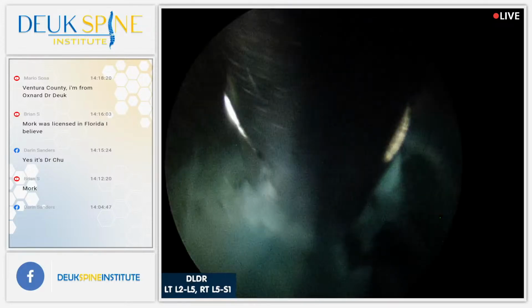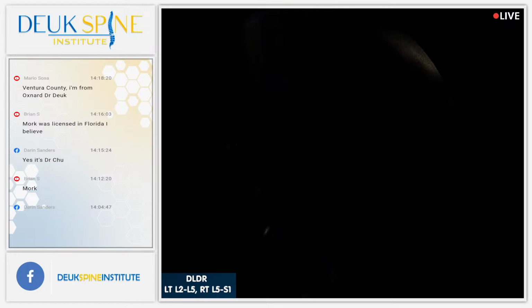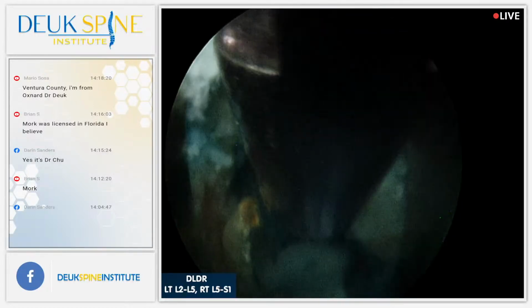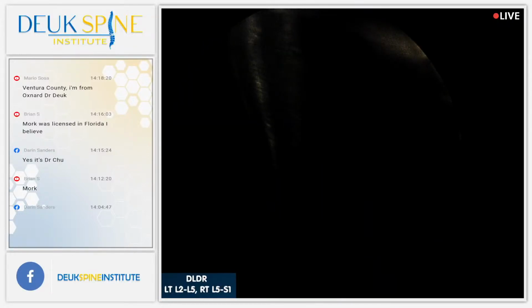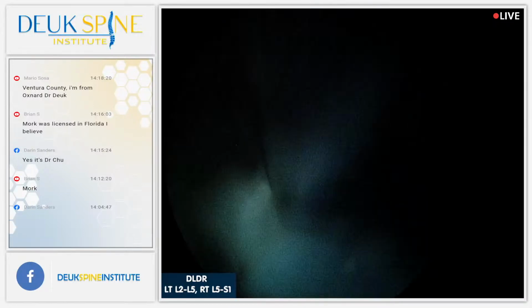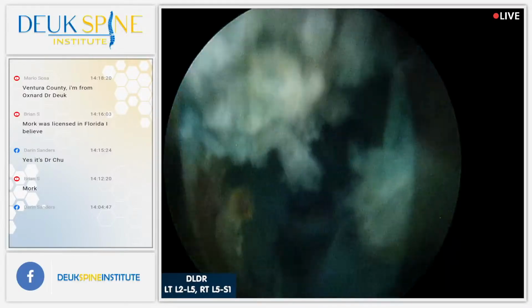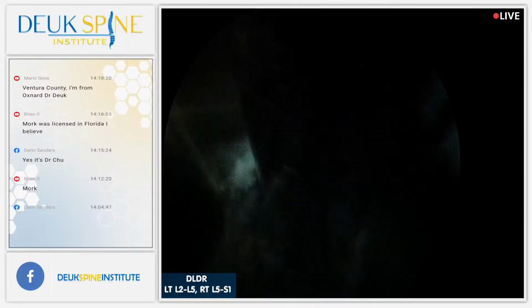No current questions, but we do have a comment from Brian on YouTube. Before you say that, if you're noticing, I'm going in with the metal grabbers and grabbing out little chunks. Those are all pieces of herniation that were in the foramen, causing foraminal stenosis. Now I've used my dilator and shoved it through the herniation, pushing it back into the disc. So I'm inside the disc right now, taking those pieces out.